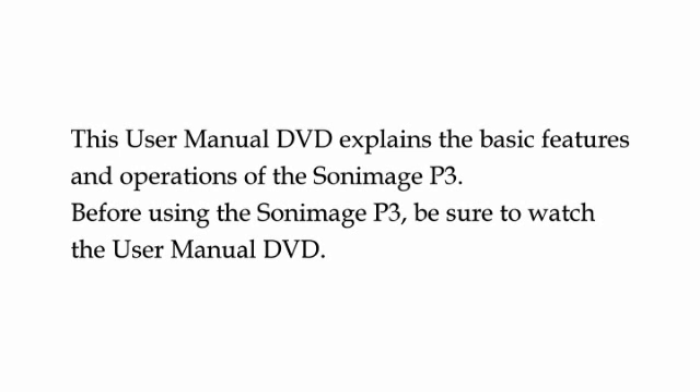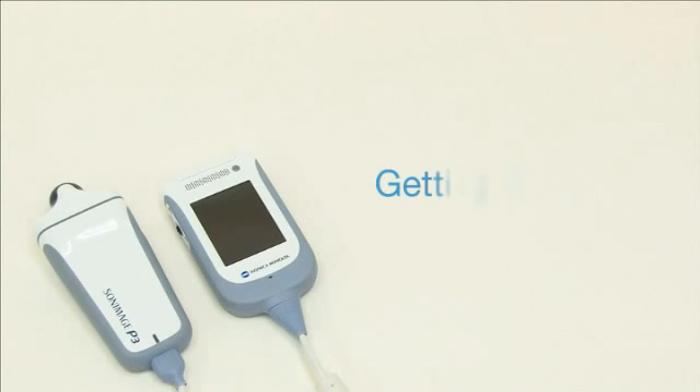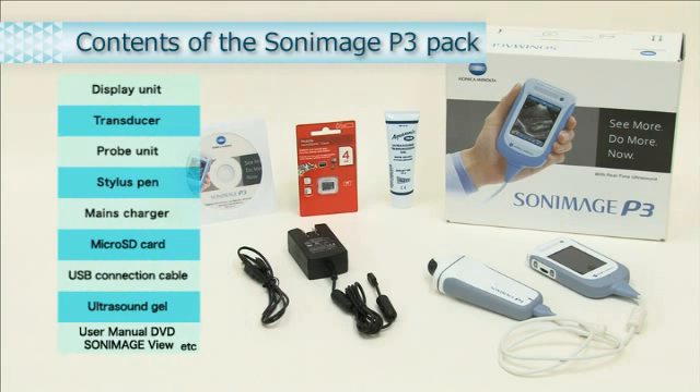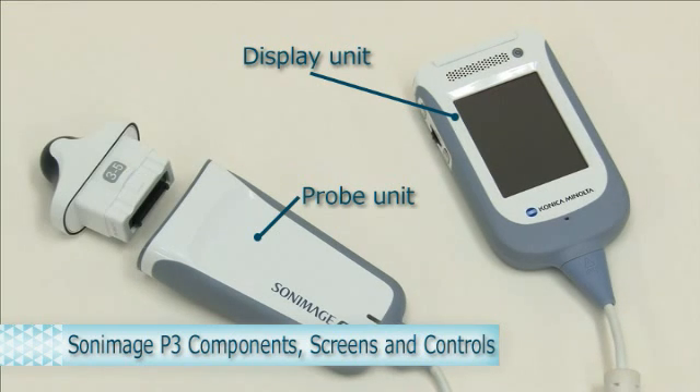This video explains the basic features and operations of the Sonimage P3. In the Sonimage P3 pack, you will find a display unit, a transducer, a probe unit, a stylus pen, a mains charger, a micro SD card, a USB connection cable, ultrasound transmission gel, and the user manual DVD. The Sonimage P3 consists of a display unit, a probe unit, and a transducer unit.